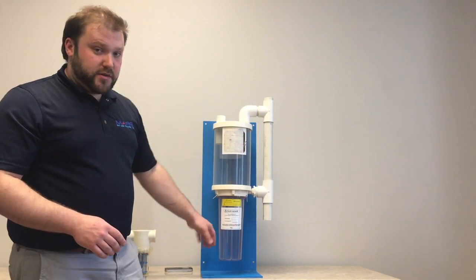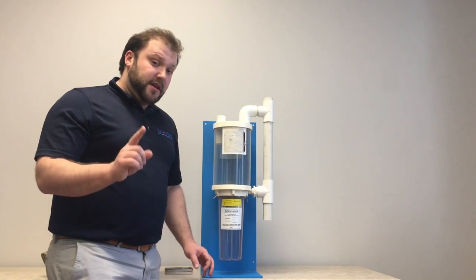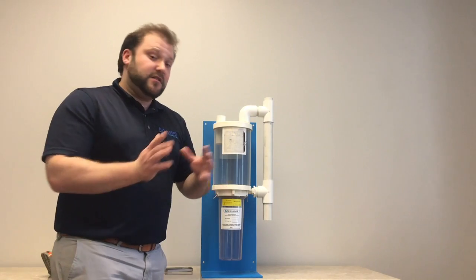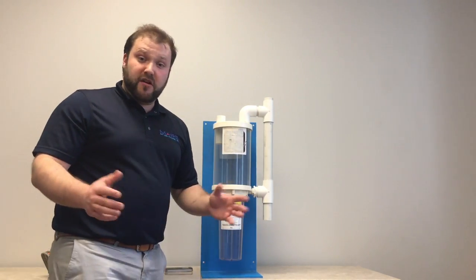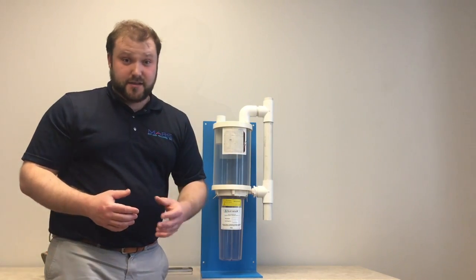Filter-based amalgam separators, such as the SolmeteX, require their filters to be changed once a year or 12 months, or when it's full, whichever comes first. It's not one or the other. If you have a half-filled filter after 12 months, the system needs to be changed to become compliant.